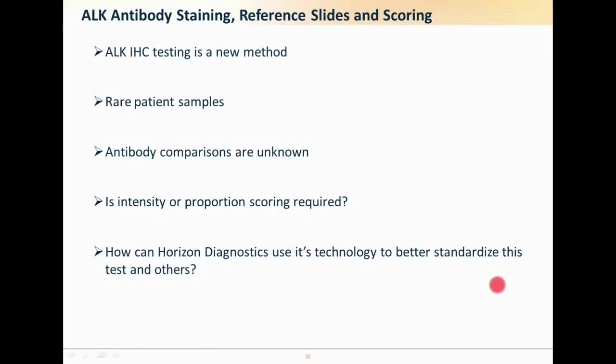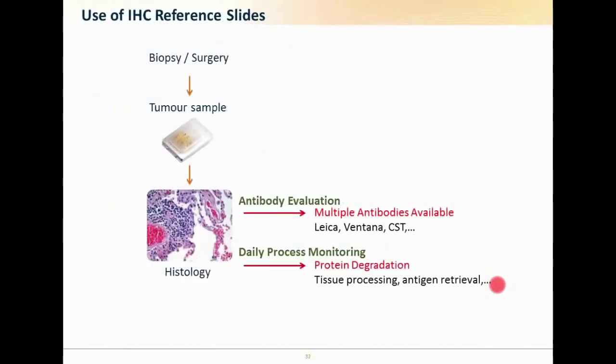By knowing that you've got a 1+ and a 3+ at this point, when it comes to evaluating or analysing the treatment or successive treatment, you can then apply it back to the test. Unless you've got a reference slide at this point in your test, you won't have any way of benchmarking what you've seen. So although it's not essential for, say, ALK to have reference slides in now, by having a reference slide, you'll be able to retrospectively use the data from post-treatment to work out the success of it, and maybe then help to personalize the treatment moving forward.